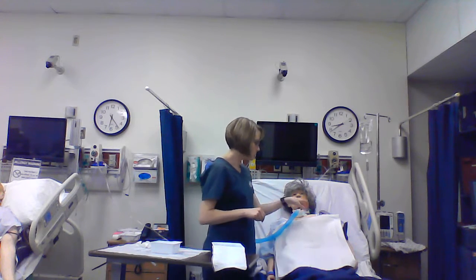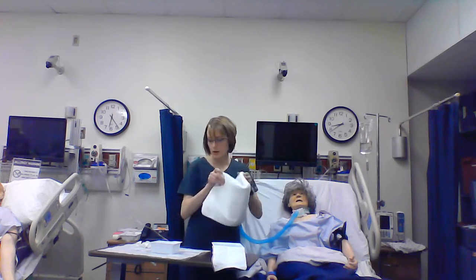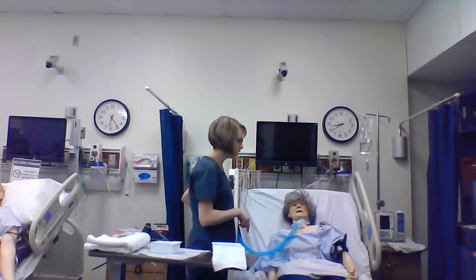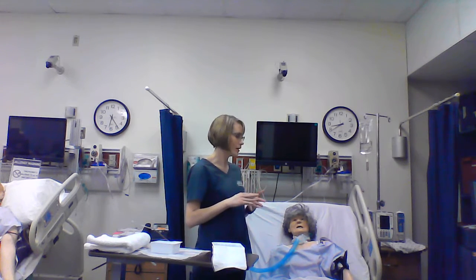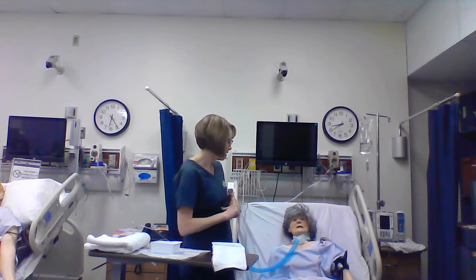She did great with this procedure, so I would go ahead and clean up my mess, clean up my station here. I'm going to lower Opal back down to earth. I'm going to make sure her call light's in reach so that she has it. I also want to go ahead and listen to her lung sounds again, right? So we've suctioned her now. I've done trach care. I want to make sure that she's breathing much better, that her sats are better, that her vitals are better.